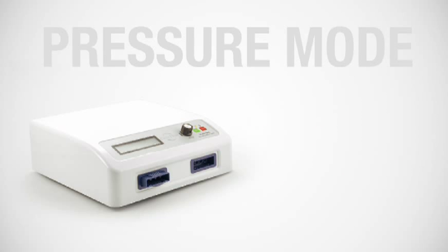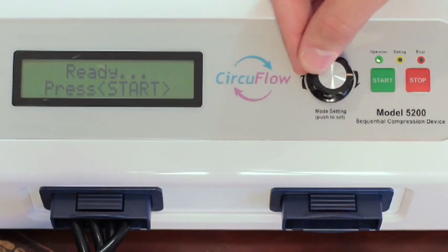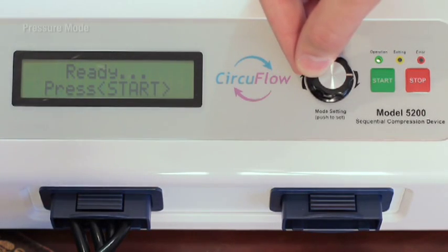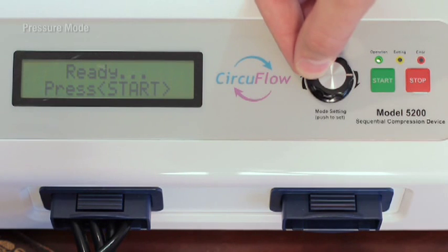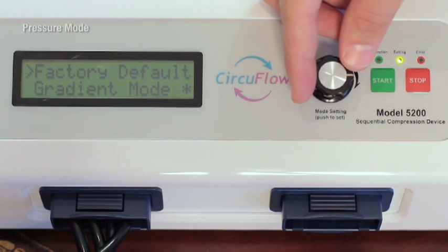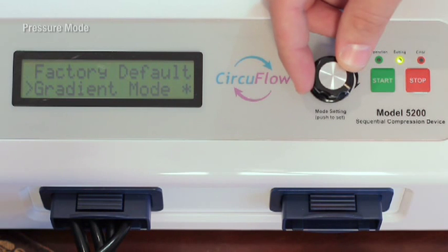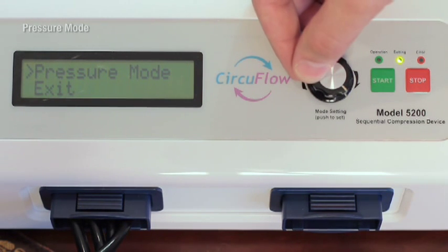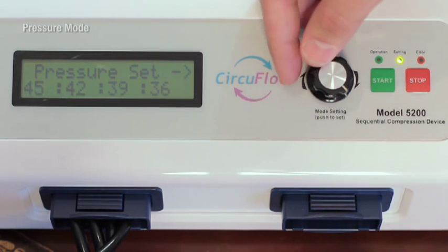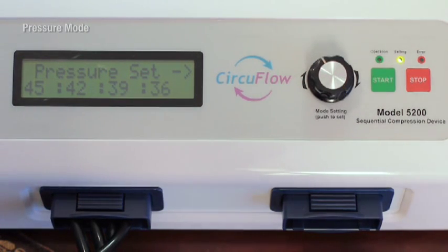After you have placed the sleeve on the patient, press the shuttle knob to access therapy mode settings. Turn the shuttle knob to the right to select pressure mode. Note that the asterisk indicates which mode is currently selected. Press the shuttle knob again to access the parameters.